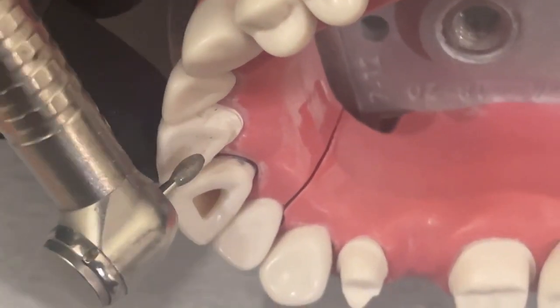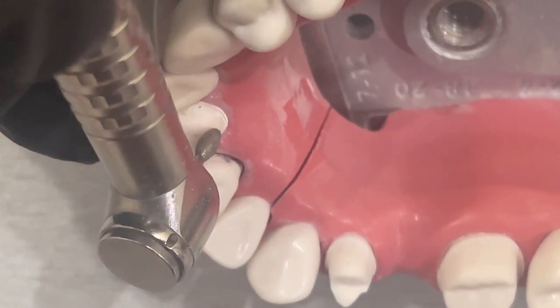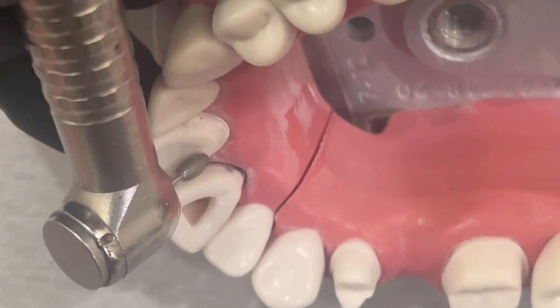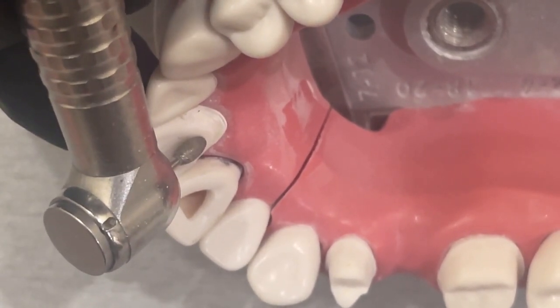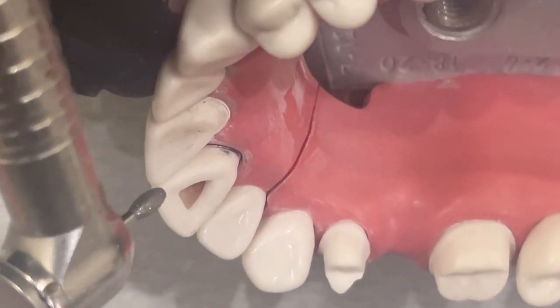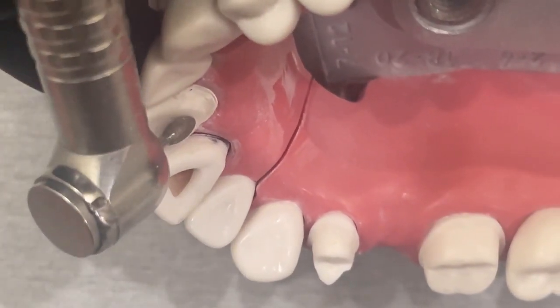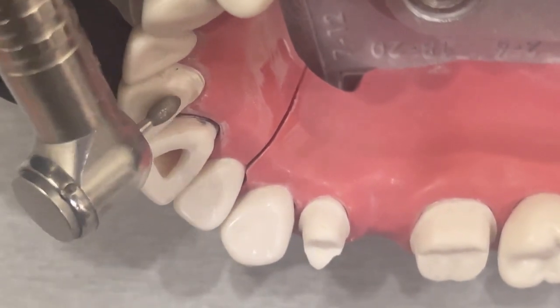The important thing to keep in mind here is don't touch this corner if you don't need to — just a little bit. I'm really just focusing on the depth of this lingual part and not going against this corner right there, because I want to keep that shape of going deep into the cingulum and then dropping down and having that lingual wall. So I'm just going to work on this deeper part first.